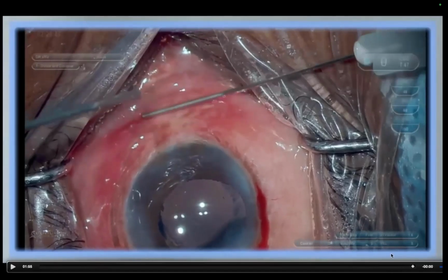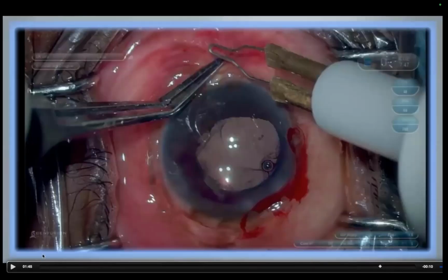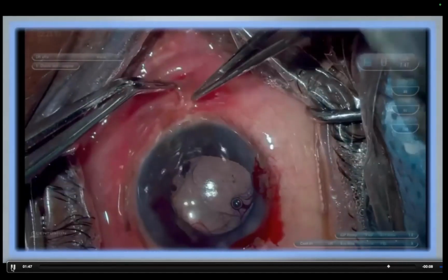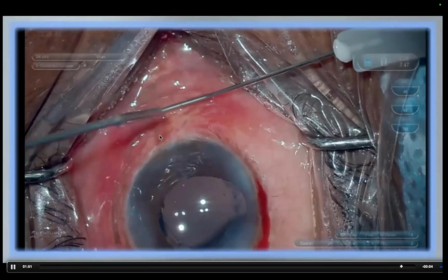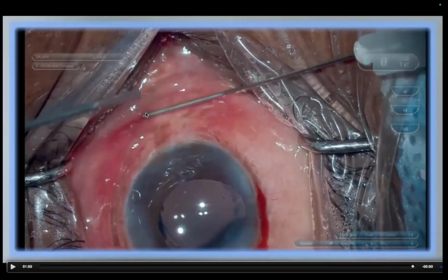What I'm showing here is a little interesting, very important. If you see, the opening in the conjunctiva and the opening in Tenon's on the sclera are at different levels. At the end of surgery, you can see the two flanges are somewhere here, whereas the conjunctiva-Tenon's opening is somewhere at the back. So once the conjunctiva and Tenon's is fibrosed and sealed after the first day, you don't have to worry about infections.